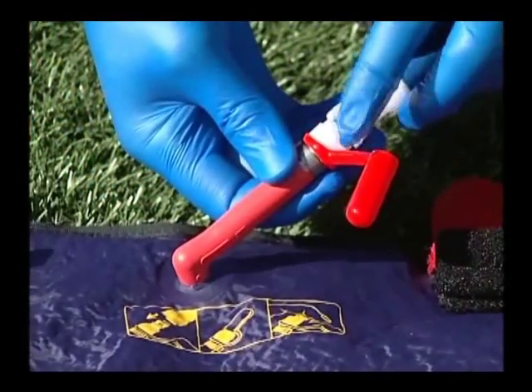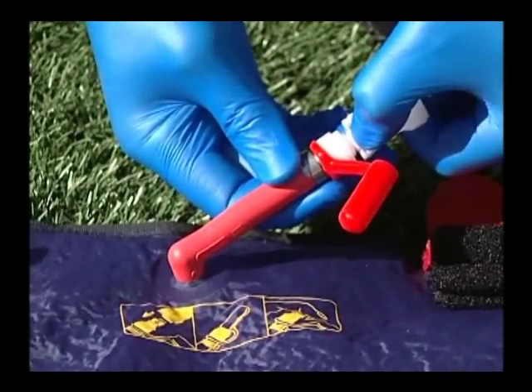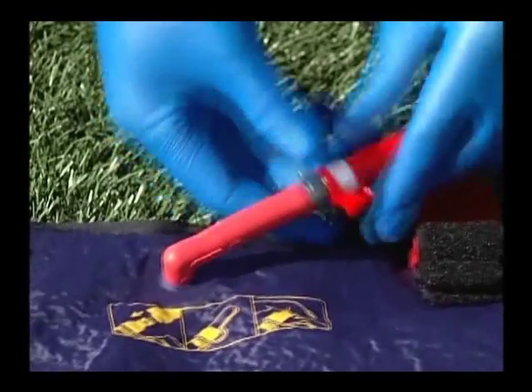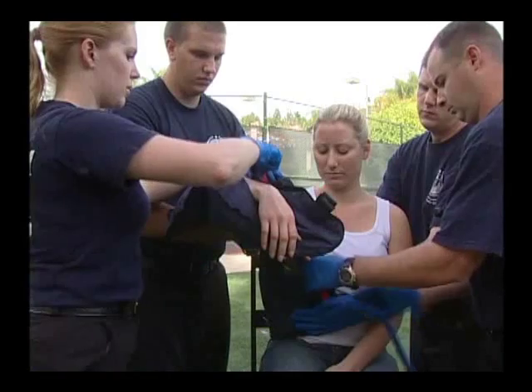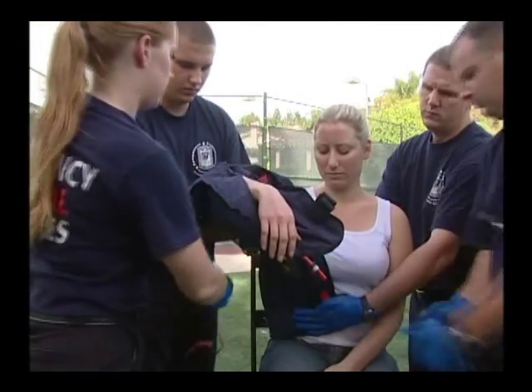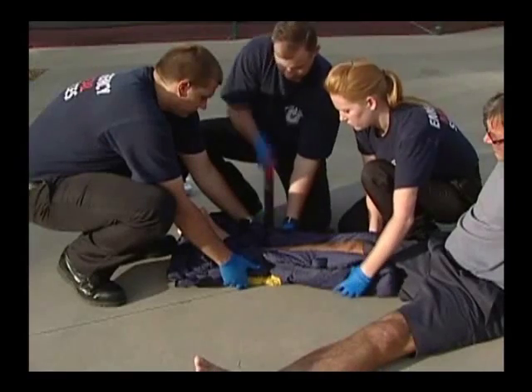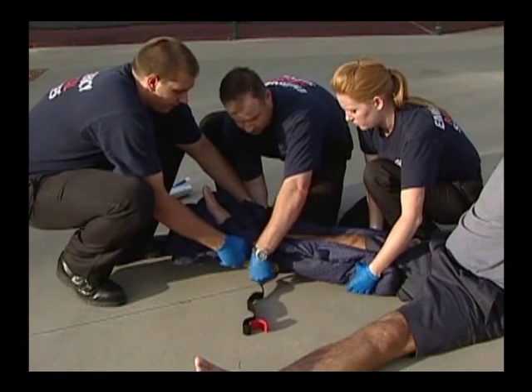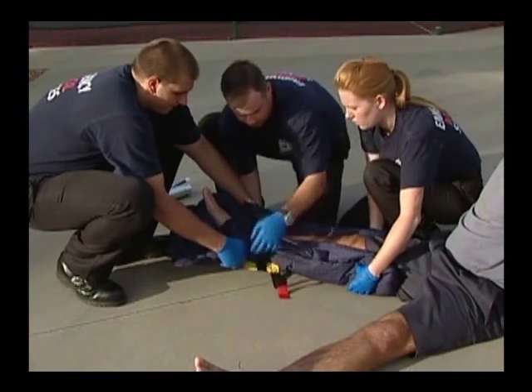Remove the pump hose from the maxivalve by depressing the metal tab on the female coupling. Place the red leashed cap back on the maxivalve. Simply pull on the red end of the hook and loop straps to extend the strap. Place the splint straps with slight tension around the splint. Secure the straps in place.